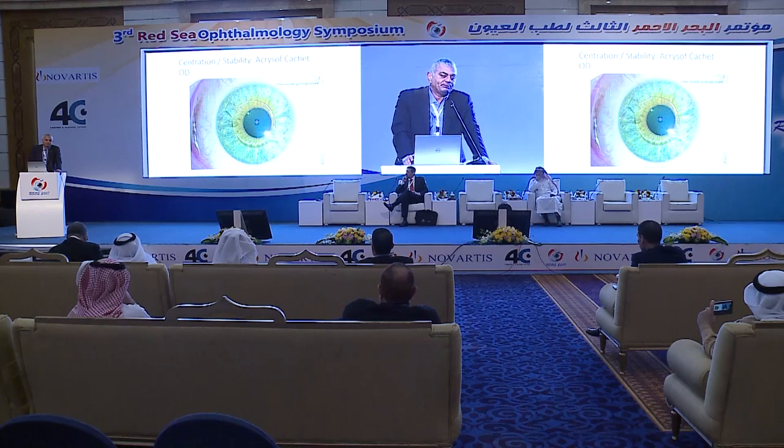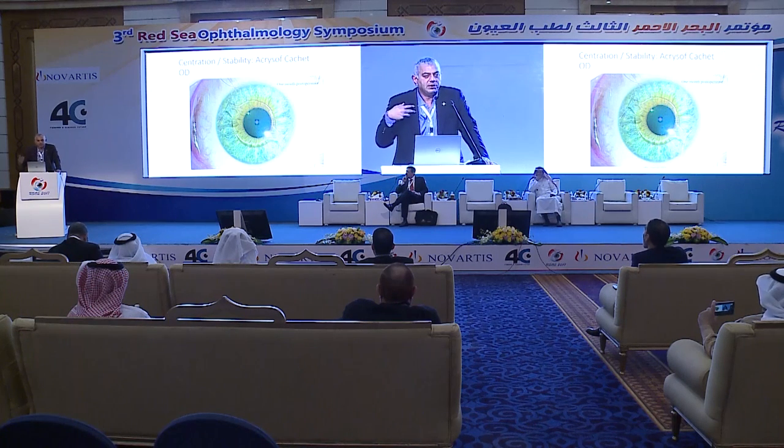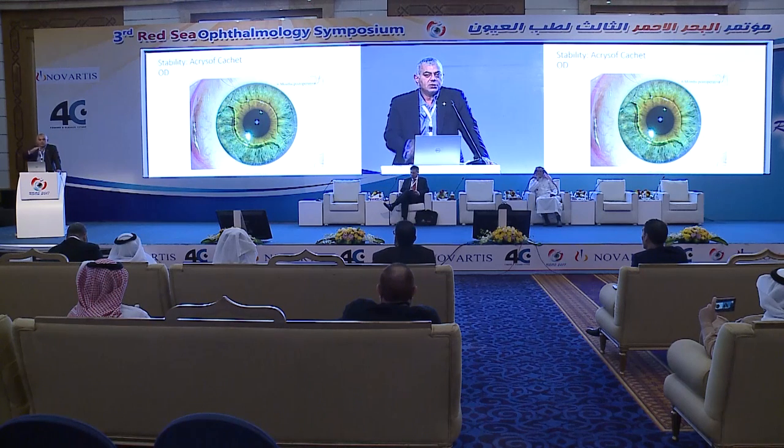Now, stability. You don't want to have a moving object in the eye, whether in the anterior or the posterior chamber. And that's why some lenses did not actually make it, because they are rotating inside the eye, like this angle-fixated anterior chamber lens that was moving inside the eye over years. For the two available lenses, the ICL and the Artisan, especially with the toric design, I use the OPD scan to assess the stability of the toric lens inside the eye. And this is the internal OPD before the surgery, and then 3 months after the surgery, 6 months, and 1 year, and I keep doing this every year.